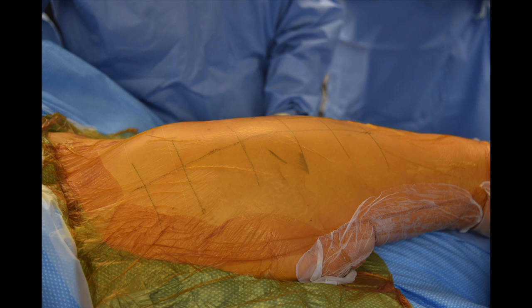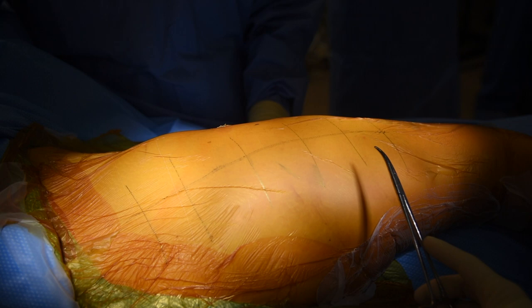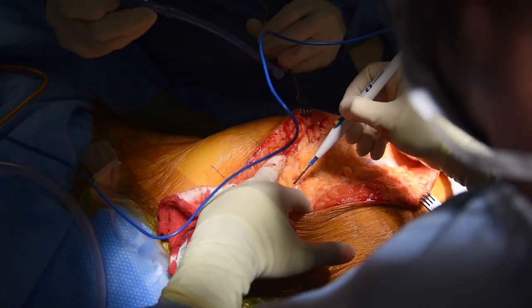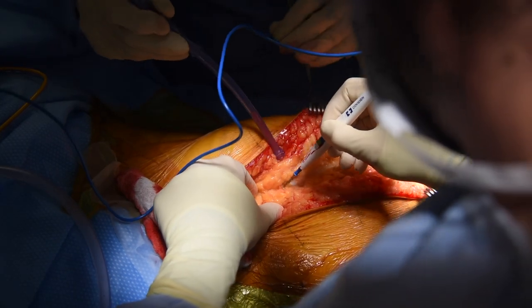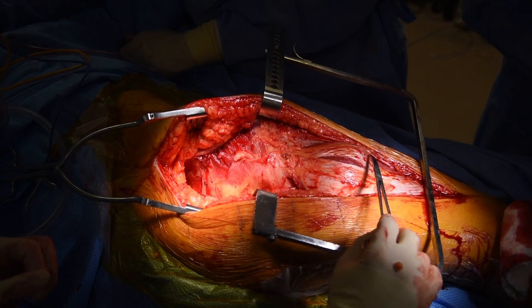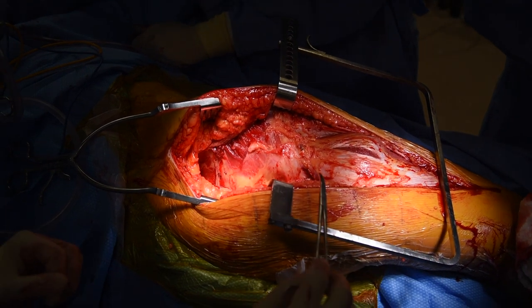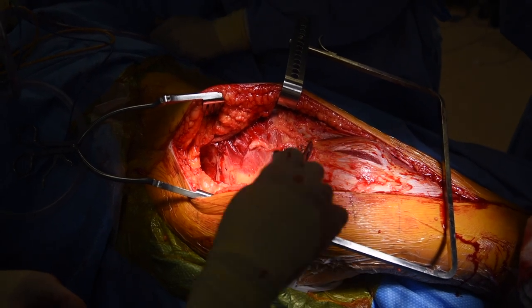The patient was brought into the operating room and general anesthesia was administered. The right femur was signed for safety measures and a proper timeout was performed. The patient was placed in a semilateral position. We incised through the iliotibial band and tensor fascia latae fascia to get down to the gluteus medius and vastus lateralis. There is a pathologic fracture from the Ewing sarcoma, and the apex and anterior portion of the fracture is extended here.